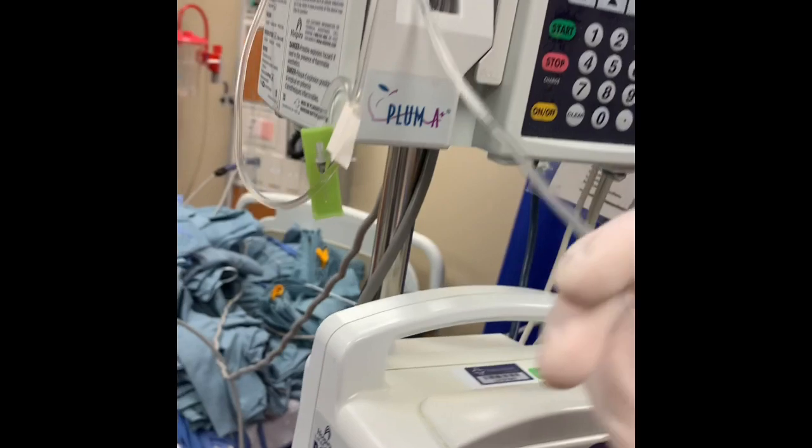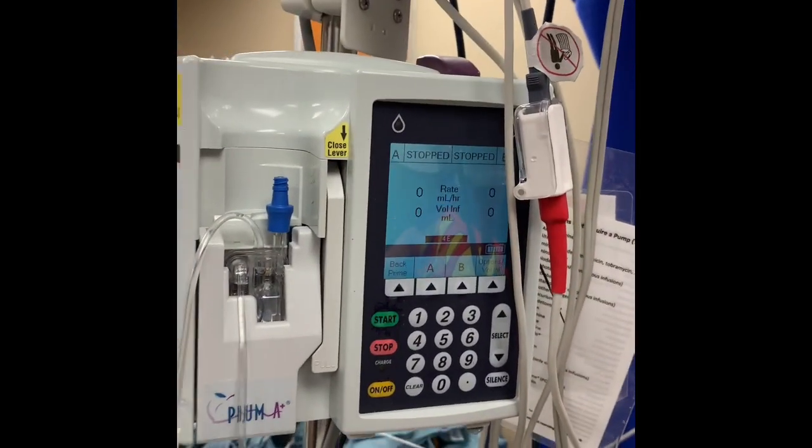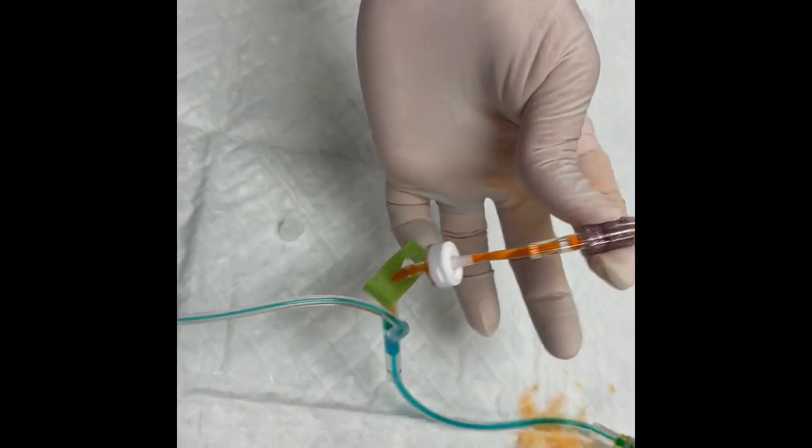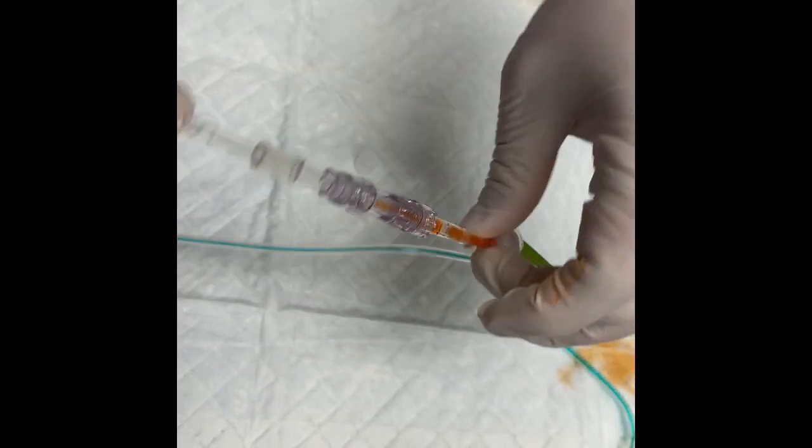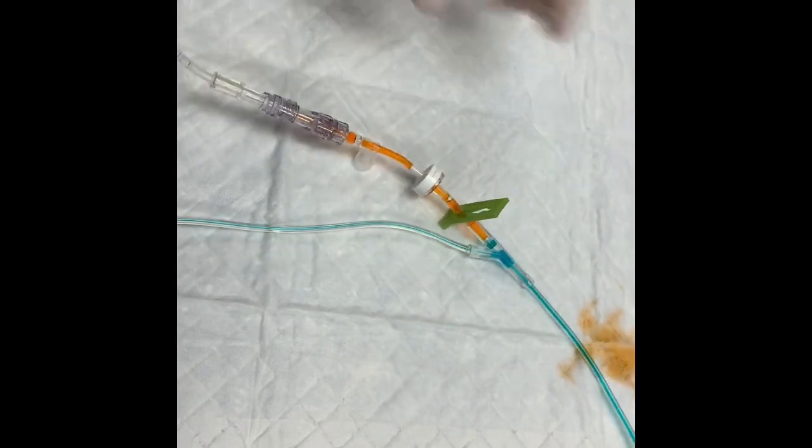If you also need to run fluids, you can run those through your Plum A pump and attach that to the port we put onto our pigtail. Because we primed it previously, there's no air in that line and we're ready to go. Fluids can run concurrently with your PCA pump.